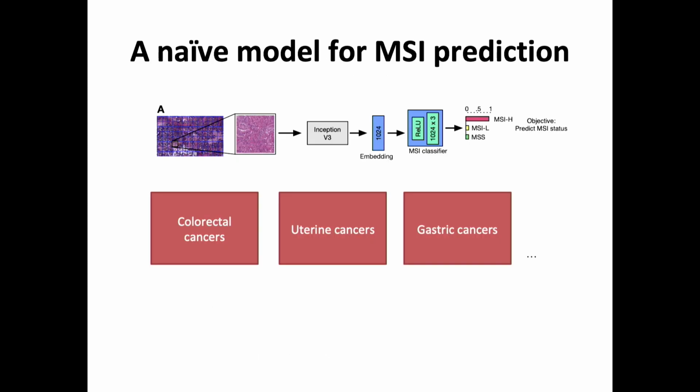So in a very naive setup, what we did is we took a bunch of histopathology images and we tried to predict whether we could get MSI status. And actually, you know what? It's not bad. It actually works pretty well. And there are already papers emerging in the field discussing how you can take those histopathology images and start to predict genomic mutations or phenotypes.